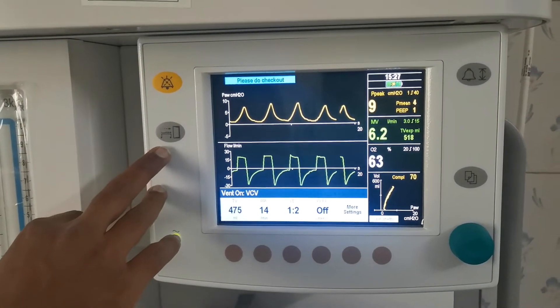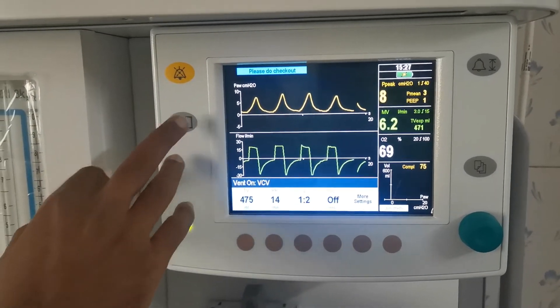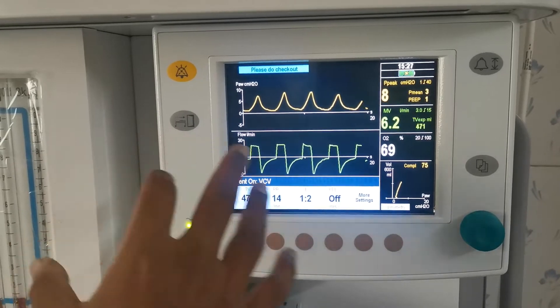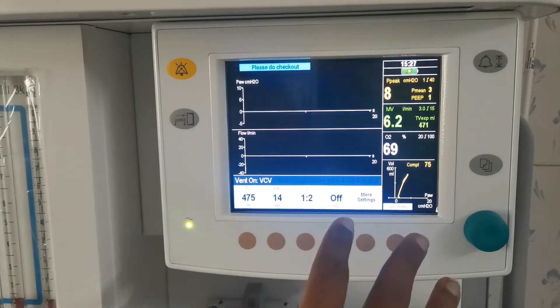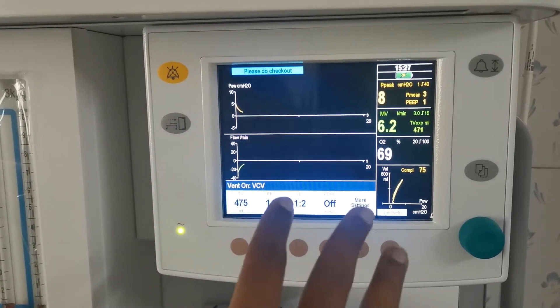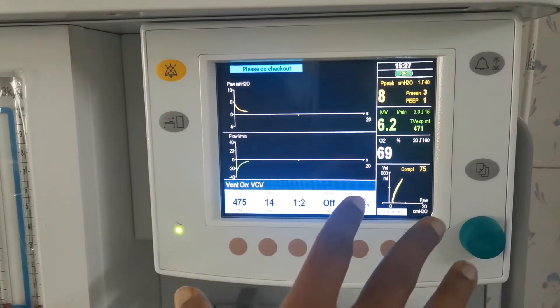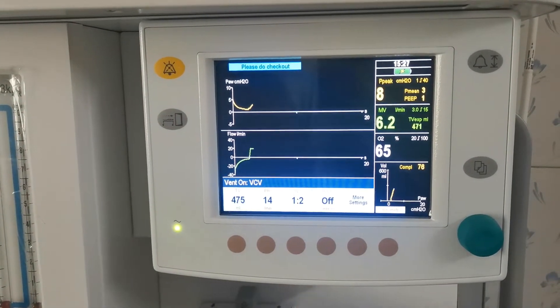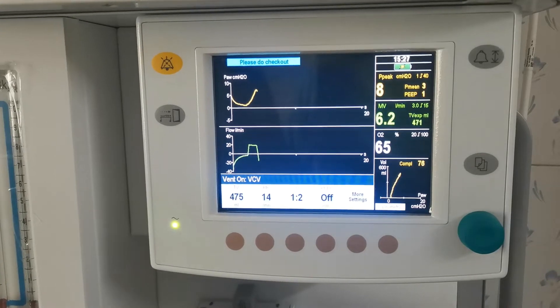This is the checkout button. Once you press it, the procedure will end — countdown.